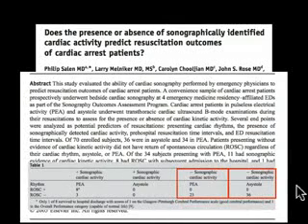There's a study going on right now. There's 61 sites. We're one of the sites looking at this exact same concept called the REASON study that Rod Mortazavi, one of the medical students, is sort of in charge of. We're looking at that now as one of the many centers doing this to try to find, is there any situation in which a patient could actually survive who had cardiac standstill on their ultrasound.